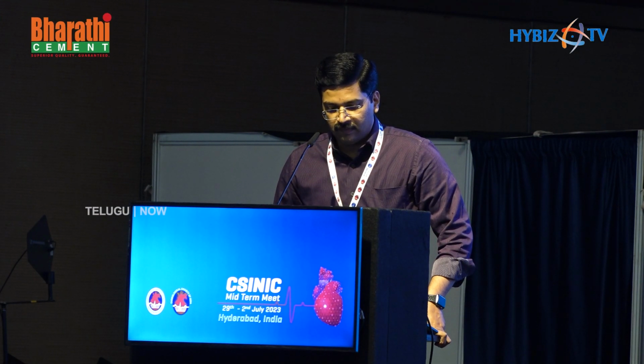Serial dilatation of the ostium with 2 followed by 3 millimeter balloon. Then sequential kissing was done with a 4 millimeter balloon in the LAD and 3.5 in the LCX. And the final POT was done using a 4.5 balloon. The final IVUS run from the LAD showed the distal stent edge was perfect. Mid LAD was measuring 5.25. Proximal LAD was 7.62 millimeter square. Proximal LMCA was 11.53. And the stent was well apposed and well expanded.